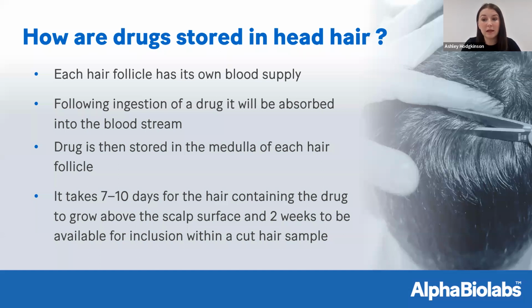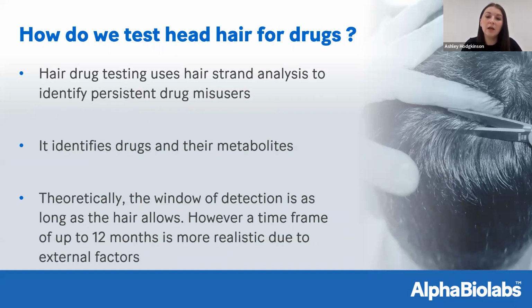So it's really important to consider that when you're sending someone for drug testing in head hair, that if you are looking for a specific time frame, that it is going to be covered within the analysis. And that's something we can help you with if you do complete a referral with us.